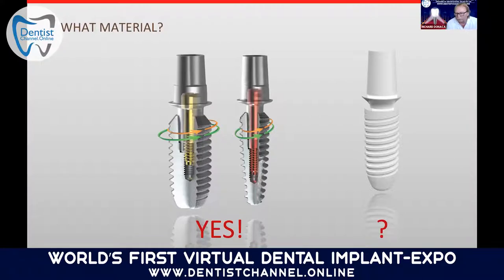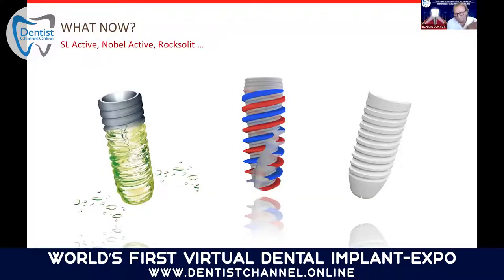There are new materials on the market now, zirconium materials, which we are also bringing out in the latter part of this year. I think it's kind of a trend. Zirconium is not the ideal material for implants, but it is, let's say, a non-metal type implant, at least in the thinking of the consumer. And this is a new trend to go to zirconium oxide materials. We also have other marketing things for surface treatments for implant materials, which are on the market now with some marketing names. I think basically everyone is understanding that titanium is the most biocompatible material at the moment.